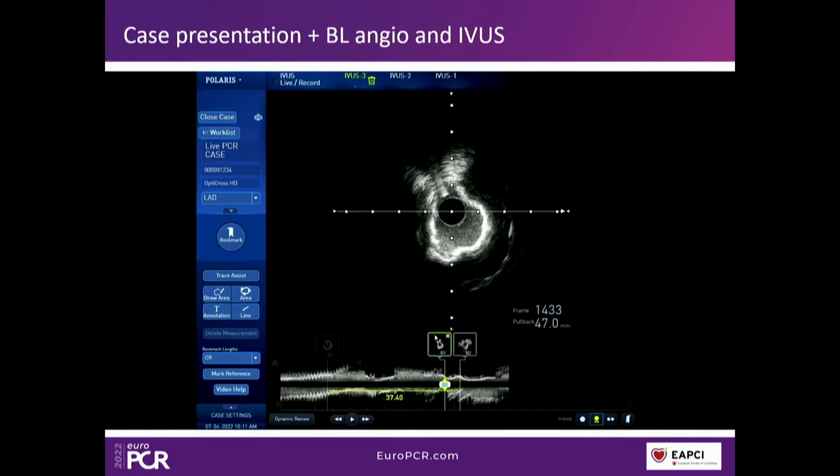We can have a talk about how we're going to treat that now. Right. Actually, looking at this angiogram, I couldn't identify a single spot free of disease. As a matter of fact, it's not just a distal left main lesion. The whole left main, LAD is diseased, the circumflex is diseased, the diagonal branches are involved.